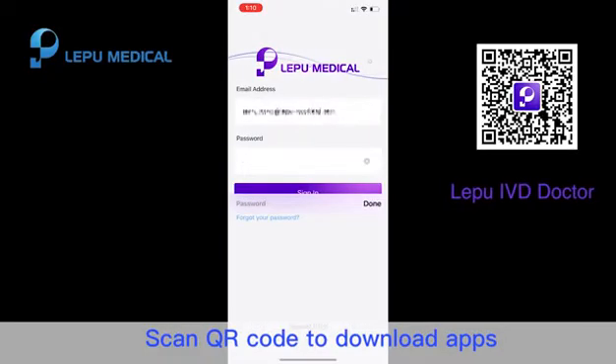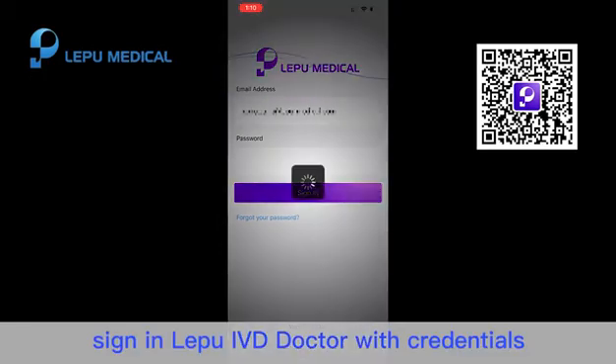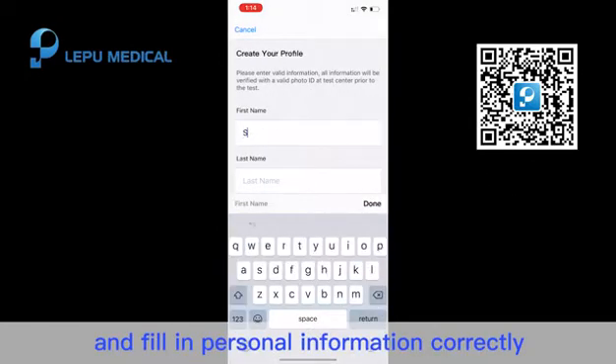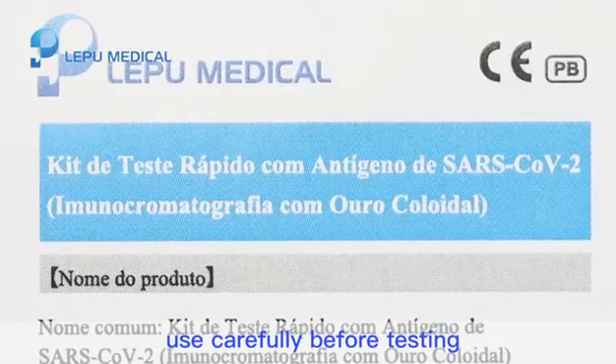Scan QR code to download the app. For doctors, sign in to Le Pu IVD doctor with credentials. For Le Pu IVD users, register with your email address and fill in personal information correctly. Please read the instructions of use carefully before testing.